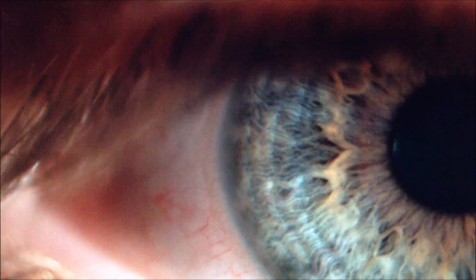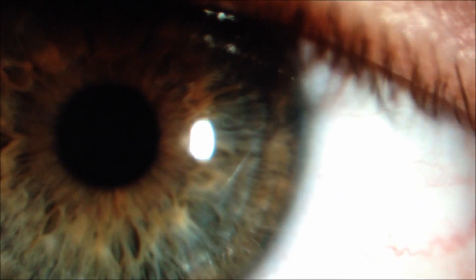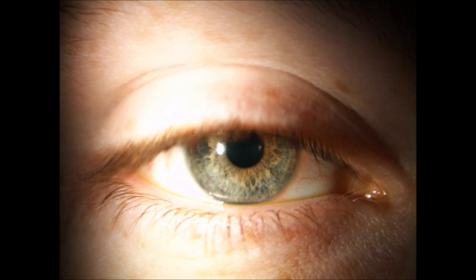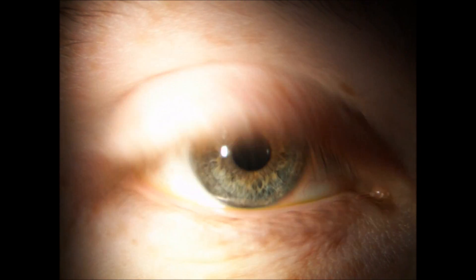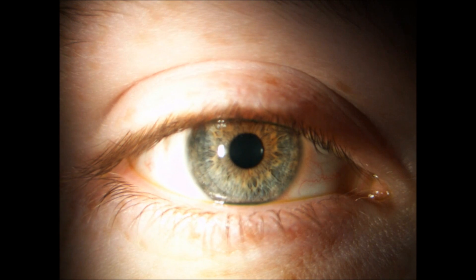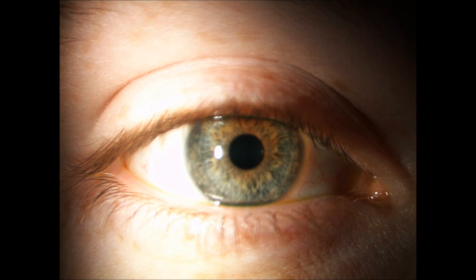That's pretty much that for this part of the examination. Now we're going to examine the tarsal conjunctiva — both superior and inferior — under two lighting conditions. We'll do it under white light to assess the lid redness, and then under blue light to assess the lid roughness. The first thing you want to do is instill some fluorescein onto the eye because this will help us when it comes to examining the lid roughness later on. So we'll just use a fluorette.